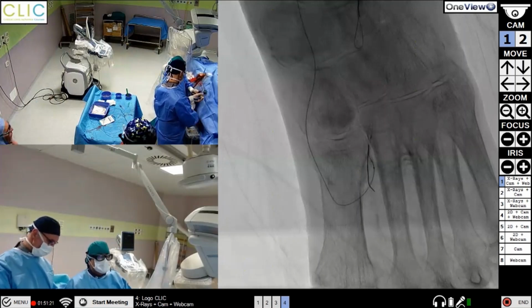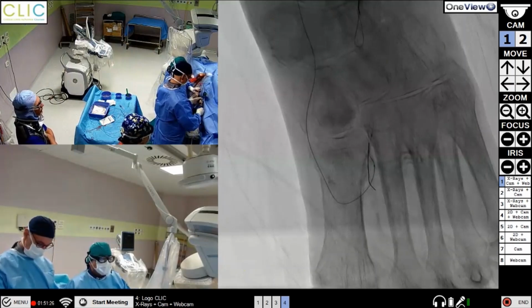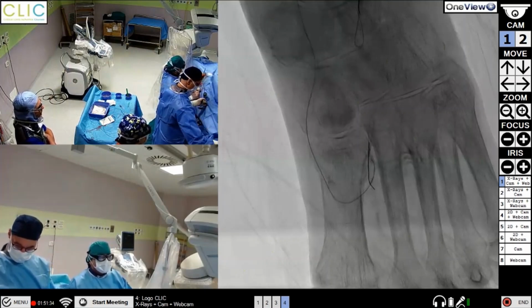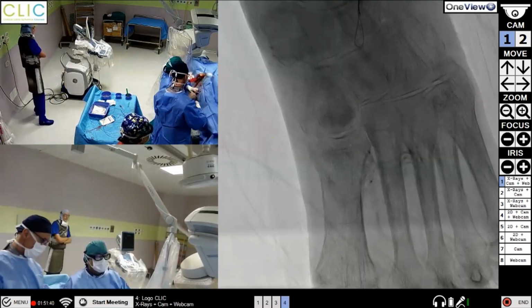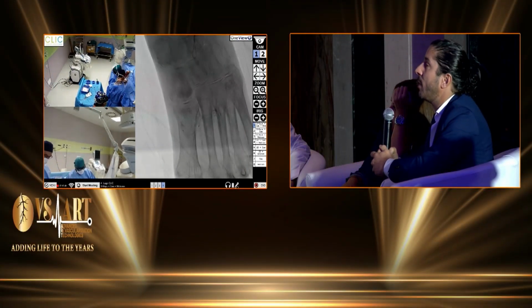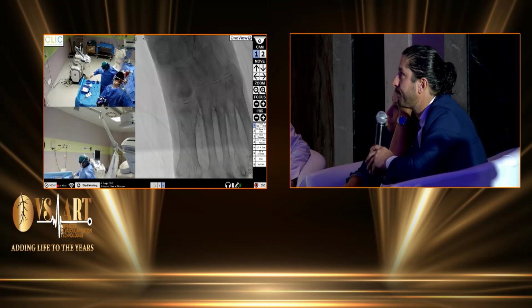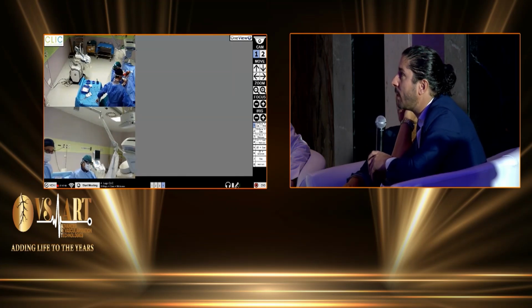You were able to see some flow in the forefoot? Very bad, a very bad outflow. I can show you now. Because from what I was able to see in the super selective from the median plantar, and I was commenting with Antonella now, it seems that the gangrene goes deep and it seems to have a deep infection. This type of blush and the absence of any collaterals. Yeah, we can remove the medication and have a look at the foot. Yeah, I think it's going to be very useful related to the last discussion.